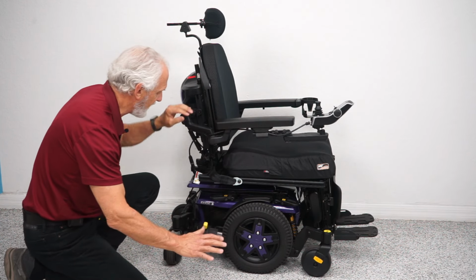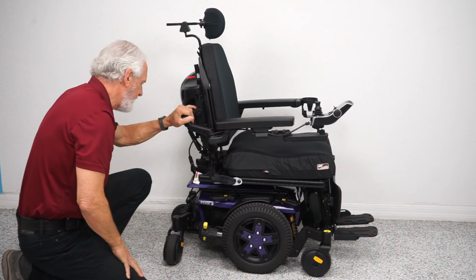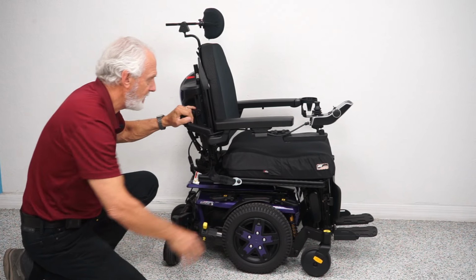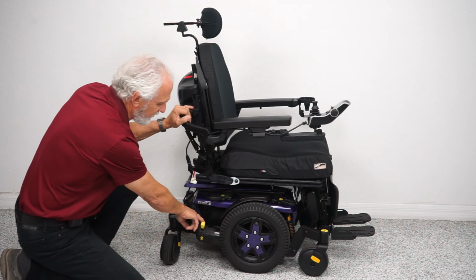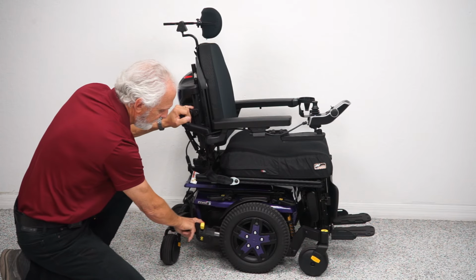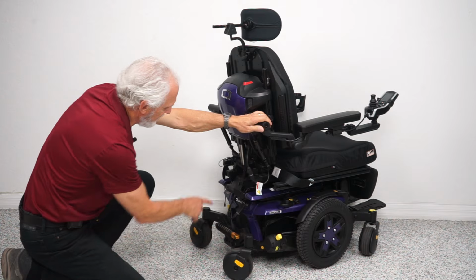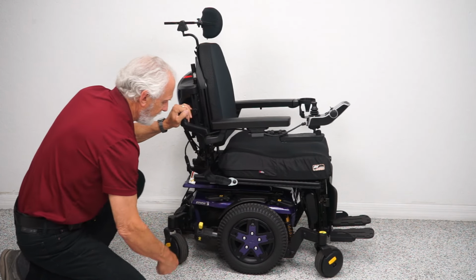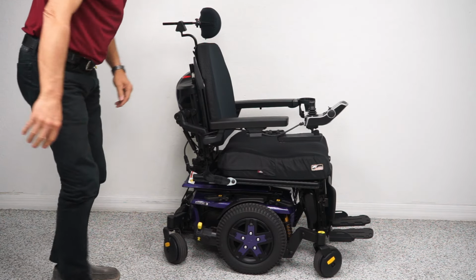It's all direct drive. If I want to push this chair, you can see the chair probably weighs about 350 pounds. So it's too heavy to lift, and it's in gear. But if you turn the power off and you push this lever, and the reason you want the power off, you want no resistance in the motor. Power is off, push the lever down, and look at that. It's that easy. There's a motor on both sides. You have to do both motors, okay? When you're done, put it back in gear, turn your power back on, okay?